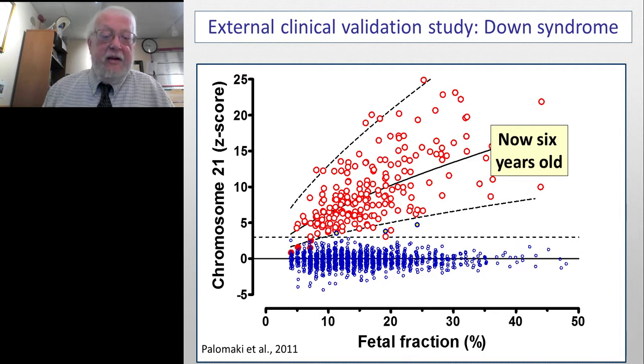And if we go down to the other end, you see all of the errors occurred at fetal fractions that were 4, 5, 6%, and you say, well, wait a minute, I don't see anything below 4. Well, all the samples below 4 were called test failures because they weren't confident that they had sufficient information to make a call. So with very low fetal fractions, one, you might have failures, and two, that's where you might have false negative results.